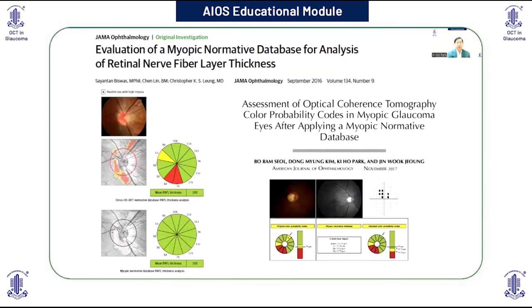Dr. Chris Leung's group and our group have shown that using a myopic normative database in OCT can remove those red disease, those pseudo defects, as you can see in the figure on the left. And also those pseudo defects could be removed by the myopic database.